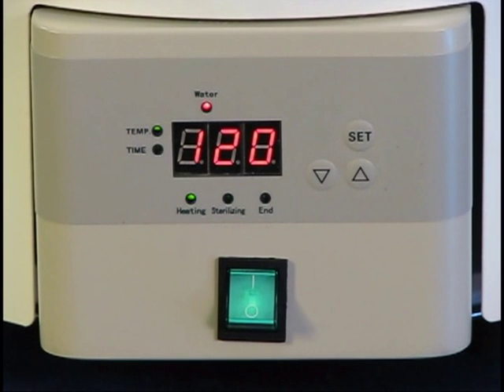Immediately after reaching your set point temperature, the sterilization timer will begin and a countdown will appear on the screen. When the sterilization cycle completes, the screen will flash END and the end cycle alarm will sound.